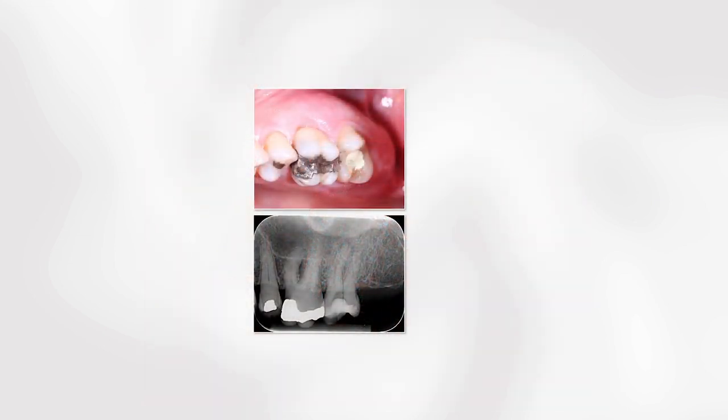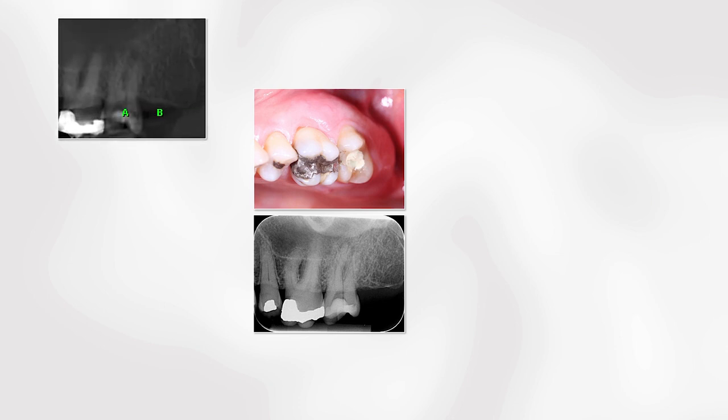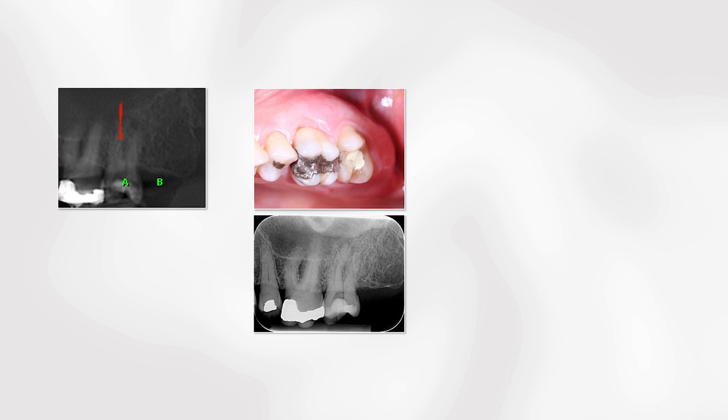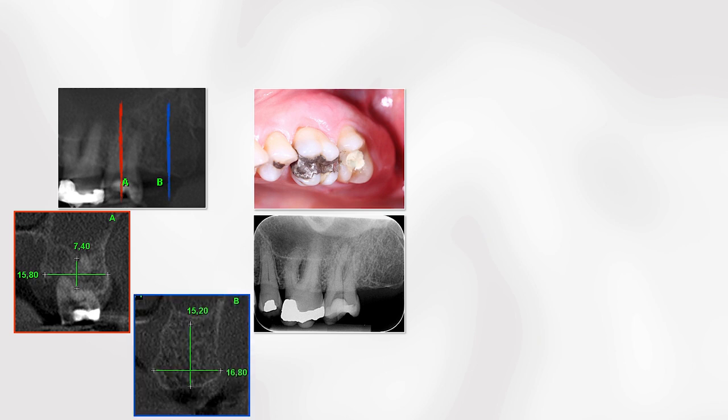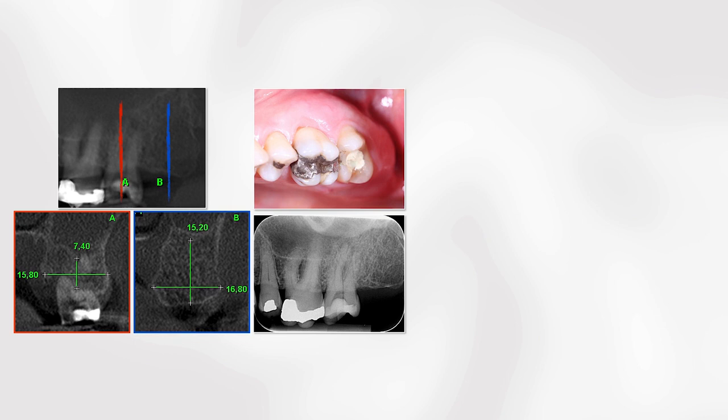In this particular clinical case, this is another patient that has parafunction. This patient fractured the second molar on the left side, a longitudinal fracture. But through this X-ray, you can see the amount of bone that we have all around this damaged tooth. Not only that, we have a huge amount of available bone behind this tooth. So it's very easy to deal with.